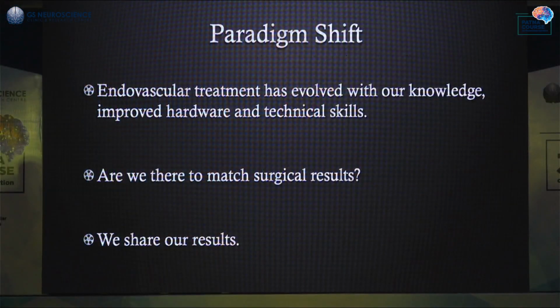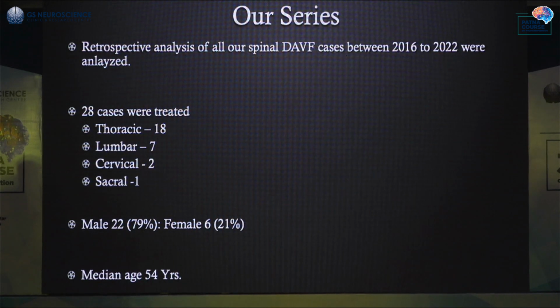So obviously the paradigm shift has happened, I believe, because with endovascular treatment, our knowledge of this disease and the hardware and the technical skills have improved a lot, and we are able to match surgical results today. So these are numbers between 2016 and 2022, about 28 cases I've treated.